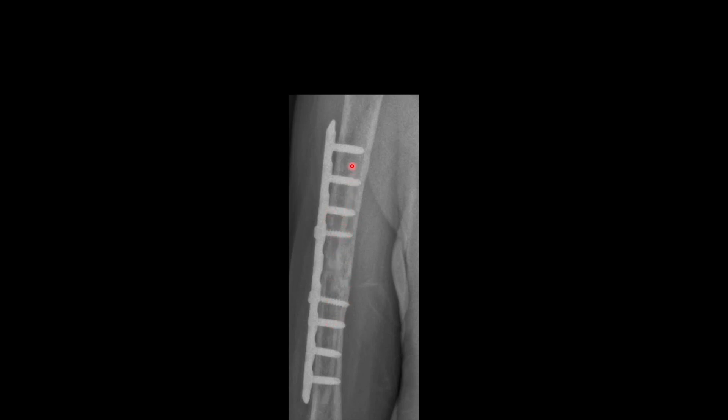In cases where the canal is very narrow, you can split the fibula into two halves and then slide the strut into the proximal and distal fragment in the same manner as shown. Thank you, hope that it helps.